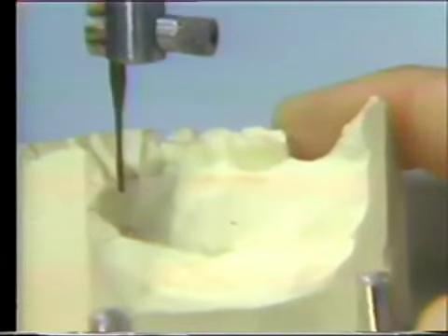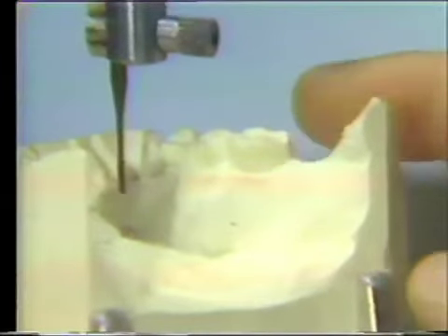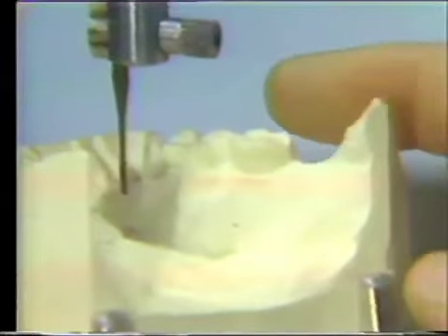So with this in mind, this means that we will be altering the wax-up of this restoration to any position that we find. So the best place to start the analysis would be on the opposite side, the potential terminal abutment of the opposite side in the neutral position.